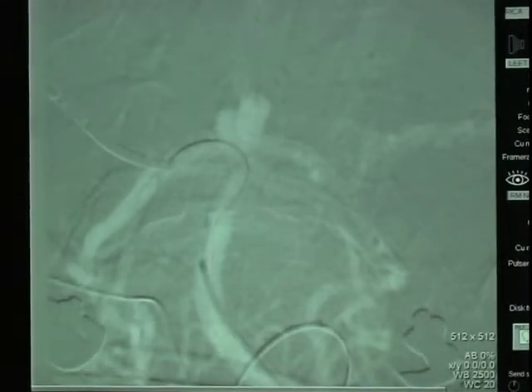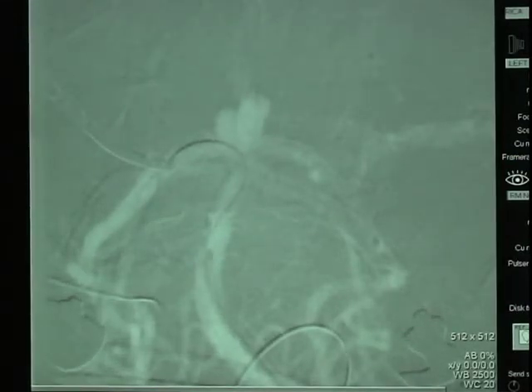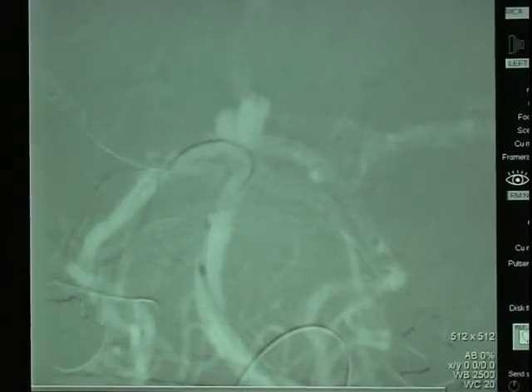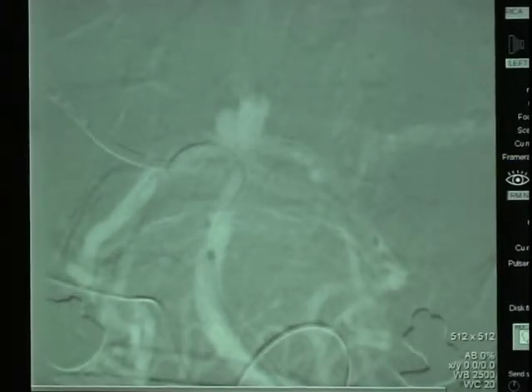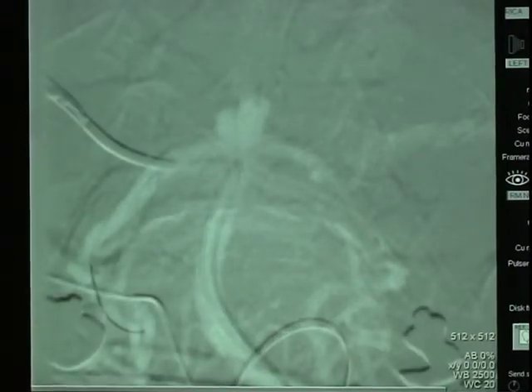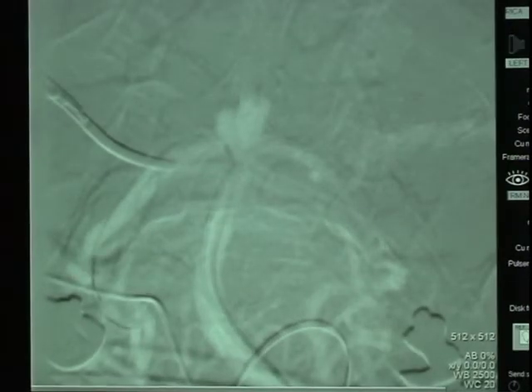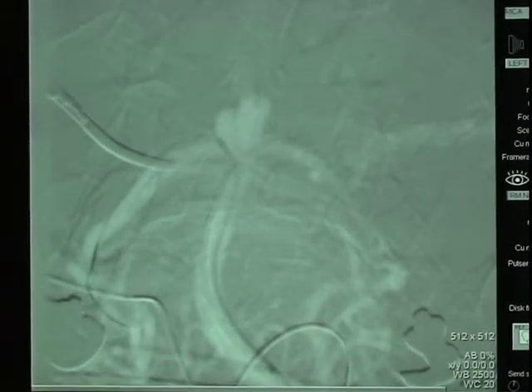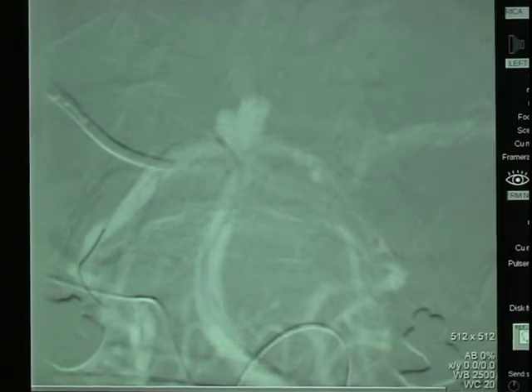Here the wire is advanced out into the right posterior cerebral artery. The second catheter is advanced over the second wire into the right posterior cerebral artery.